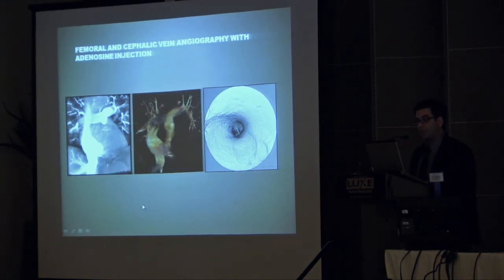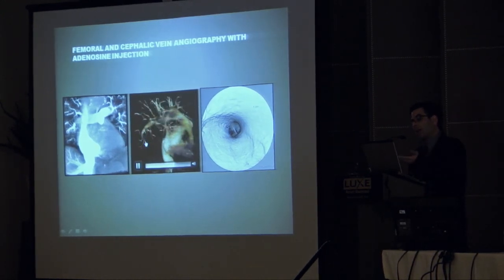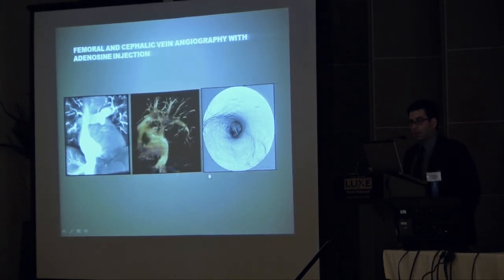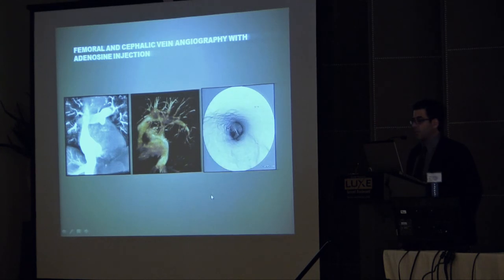And then you can take this and just do a 3D reconstruction of the right side of the heart. Look at the pulmonary arteries. I mean, you know, for something like thromboembolic disease, you can imagine how useful this could be. And you can do fly-through modes within the heart, and this is going out of the RVOT. You're in the main pulmonary artery here, and then you're going to look at the branch PAs. If you're considering how you're going to stent them, what the distance is from one PA to the other.